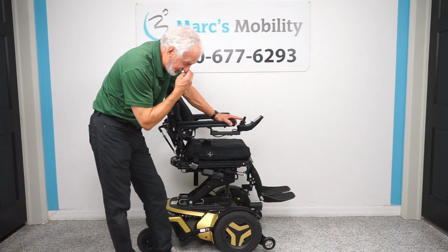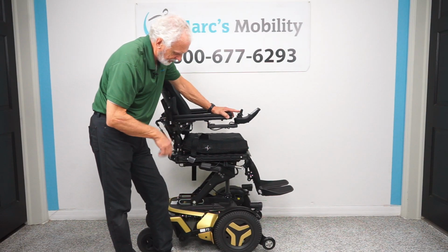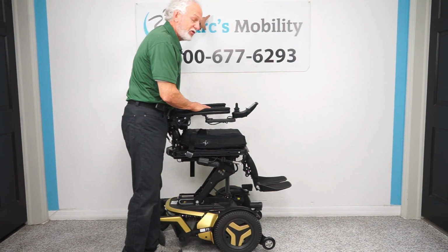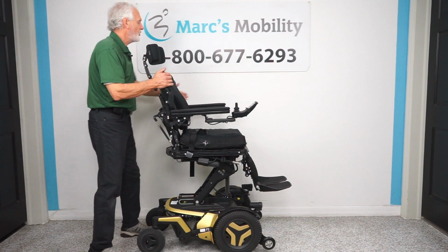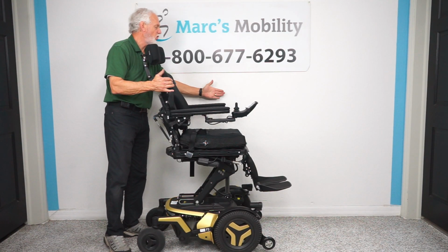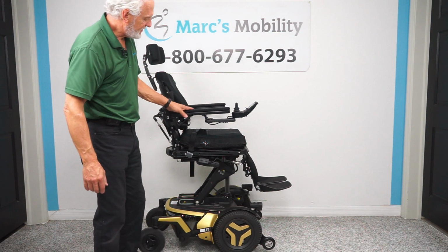But the benefit of having the seat elevated is you can also reach your stuff in the cabinet. Let's just go to the top and I'll show you. If you're in your house and you're sitting in your chair, you can actually grab stuff off the third shelf on here. And if you're going to work on a power chair in your home, you always want to work against the sink this way so you can do your dishes here away from the joystick, and you can get a lot closer to the wall if you come on an angle like this, okay? So this is the seat lift.